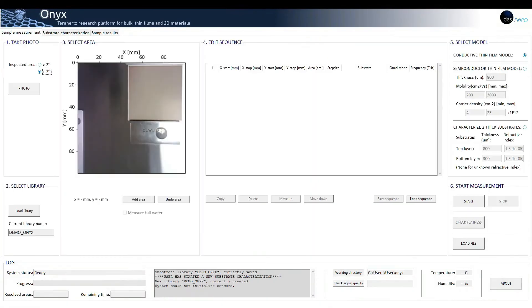The measurement procedure is very similar to the substrate characterization. This tab is divided into six different sections. One: take photo.